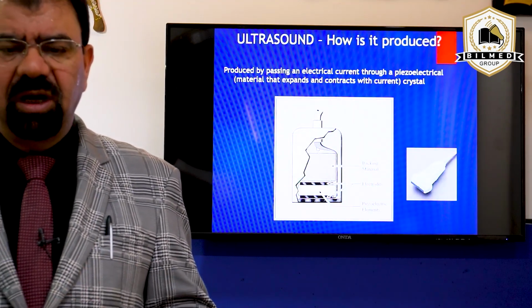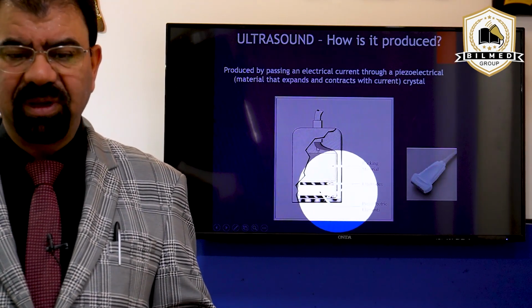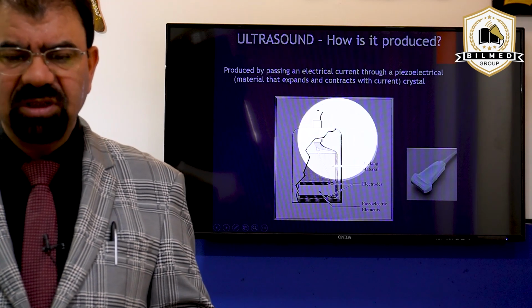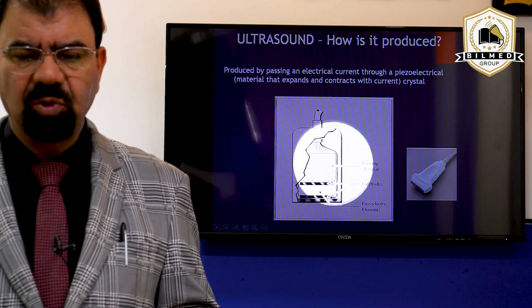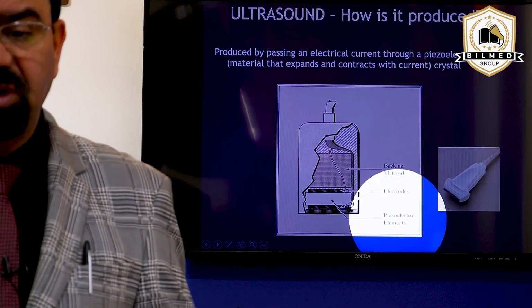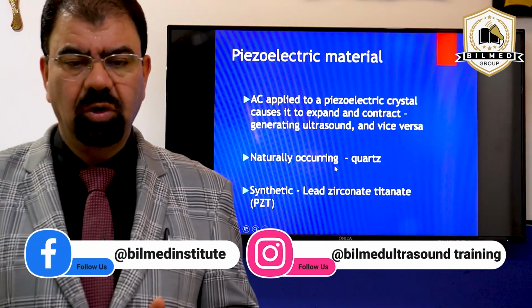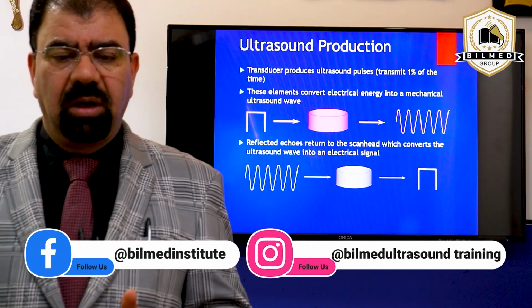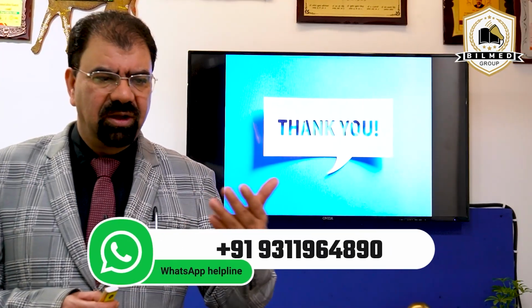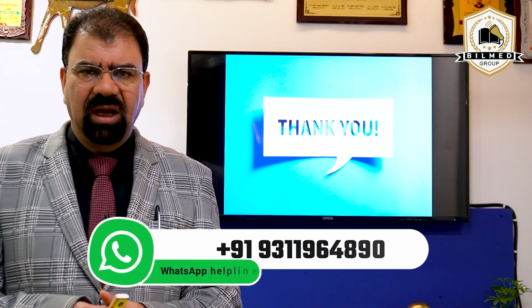So in this ultrasound probe, I have this piezoelectric crystal which is over here. This is the piezoelectric crystal. Then I have a backing material over here. So overall this is the probe we are using, and the two main components are the piezoelectric crystal, backed by the backing material which is over here. This way the ultrasound generates an image onto the monitor, and this way the ultrasound works.